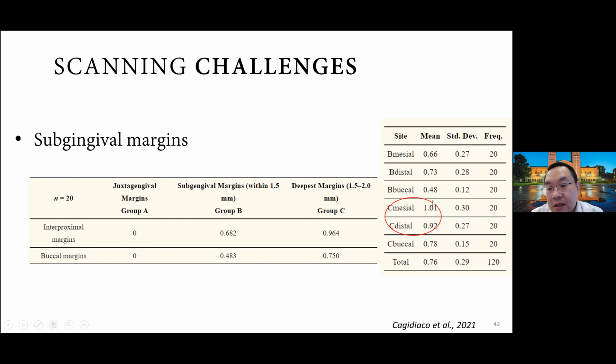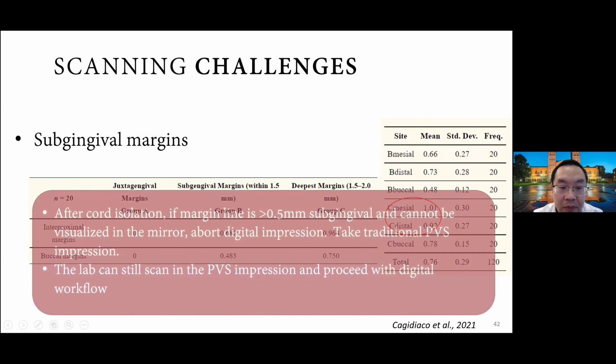Right, and there's also a location-specific factor of the tooth. On the straight mesial and straight distal is where you tend to have more errors. Of course, those are areas that are difficult for the scanner to capture in the first place, so it also tends to be an area where you have more discrepancies. So think about where you have the deep margins.